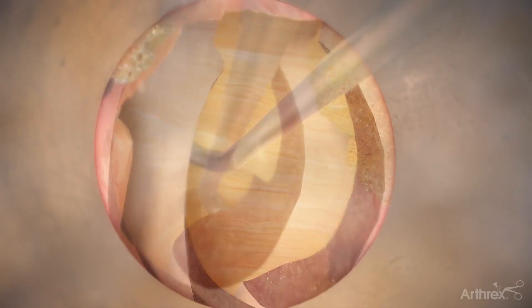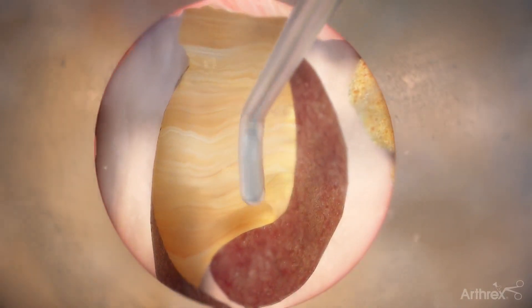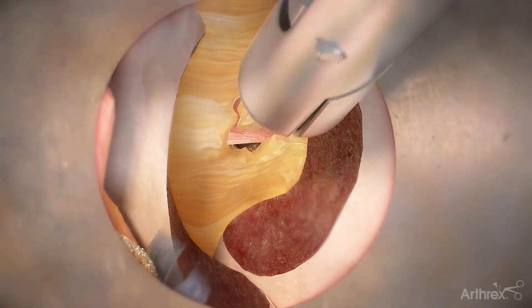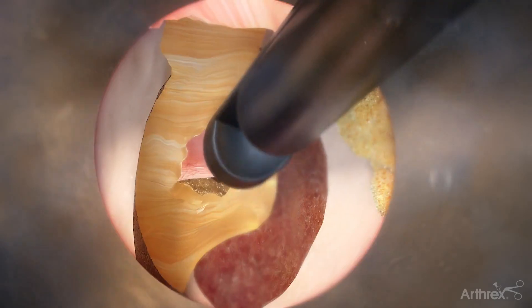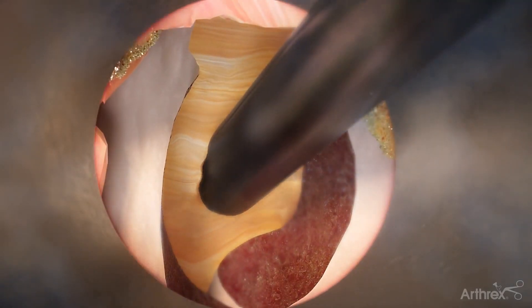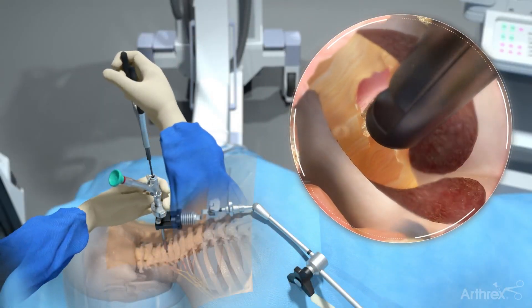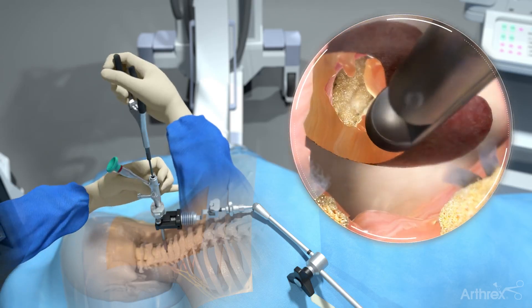Identify the ligamentum flavum. Working from caudal to cranial, dissect the ligamentum flavum using Kerrison rongeurs and other instruments. Throughout the procedure, visualize the working end of the instruments prior to removing tissue by rotating the endoscope.